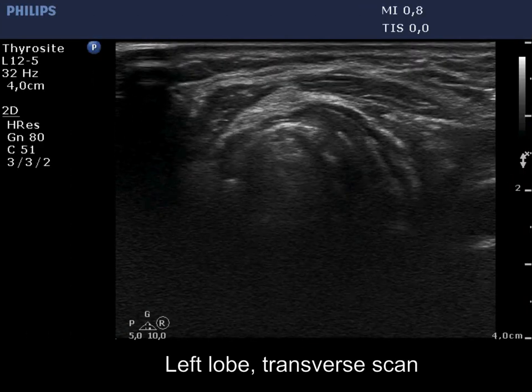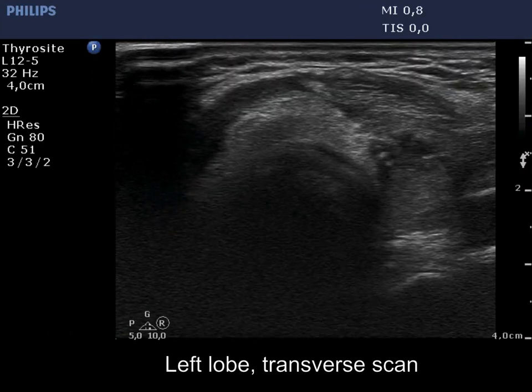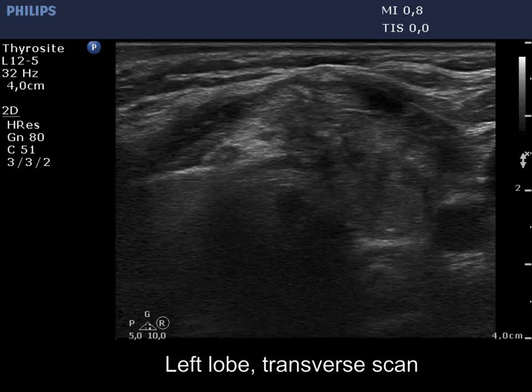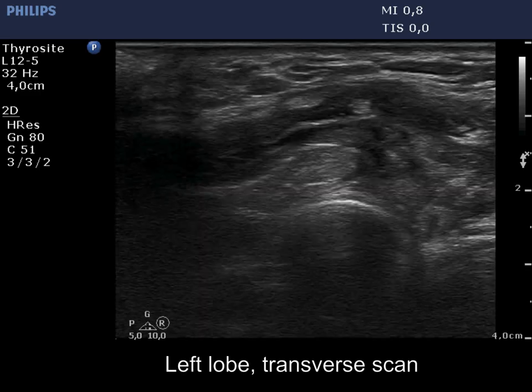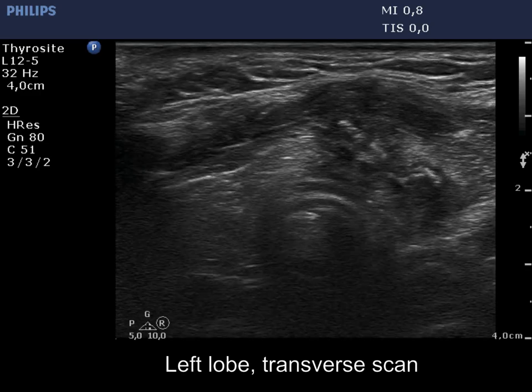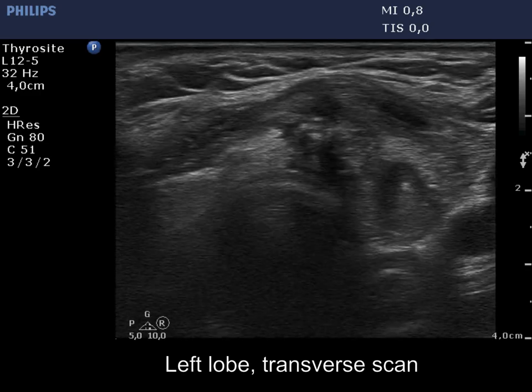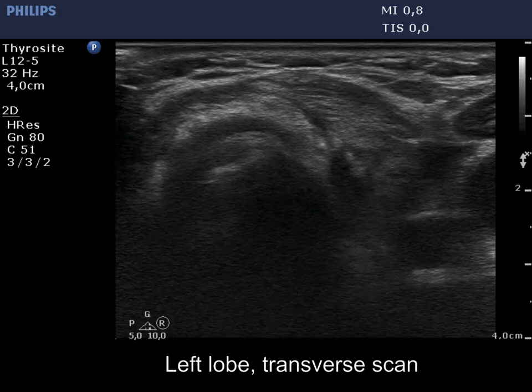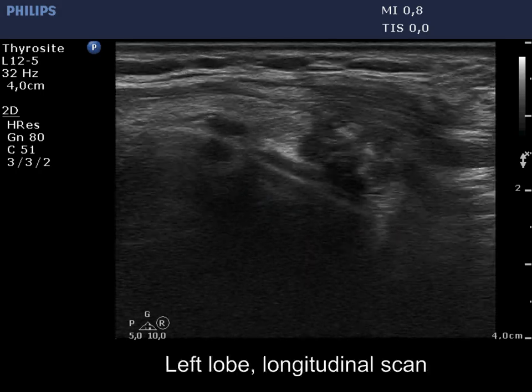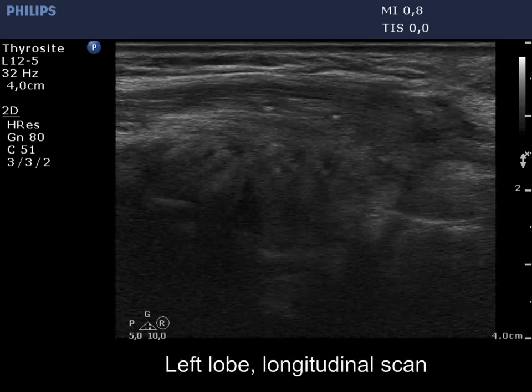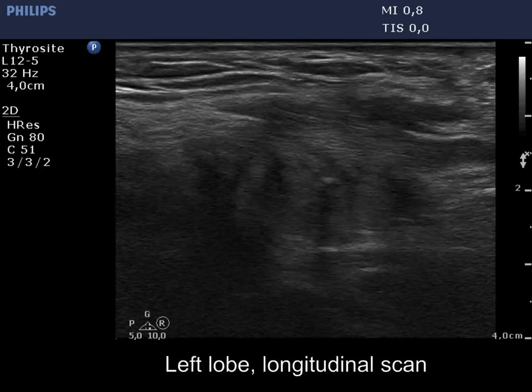There is an inhomogeneous mass in the left thyroid bed which is composed of discrete areas of different echogenicity. They contain hyperechogenic irregular granules which may correspond to surgical thread.